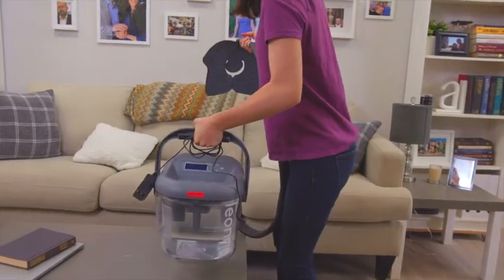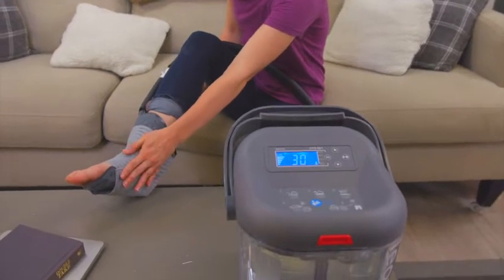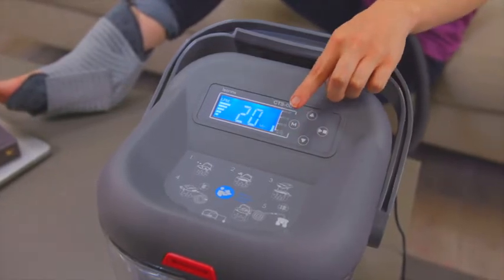To begin your cooling therapy, apply the pad to the affected area and secure it into place utilizing the elastic bands. Then turn on the machine with the switch at the back of the lid and select your session cycle time of 30 minutes or less and click play.